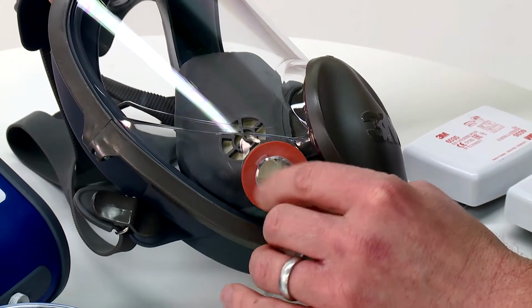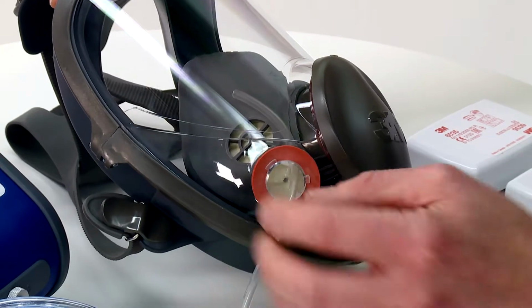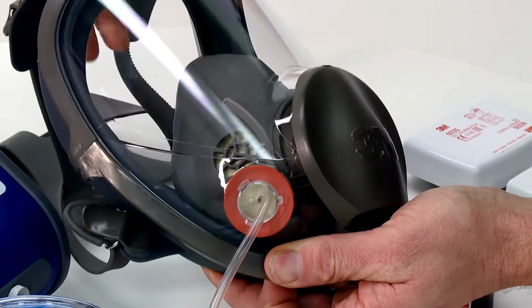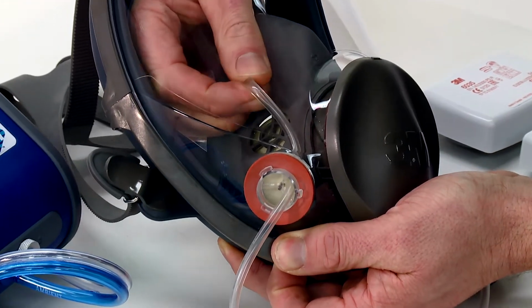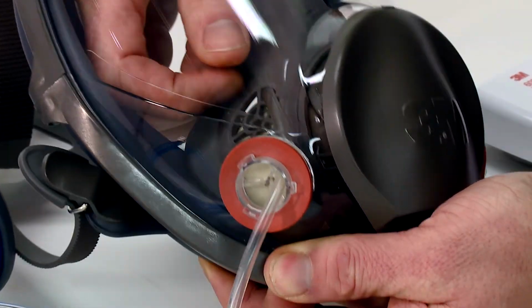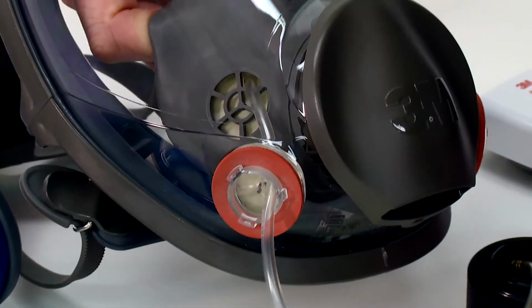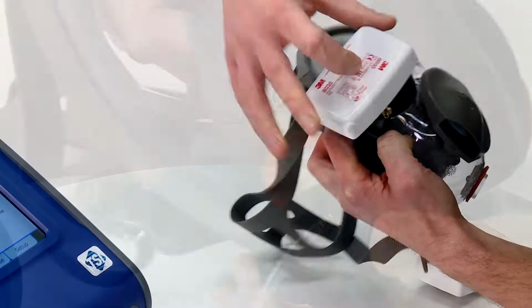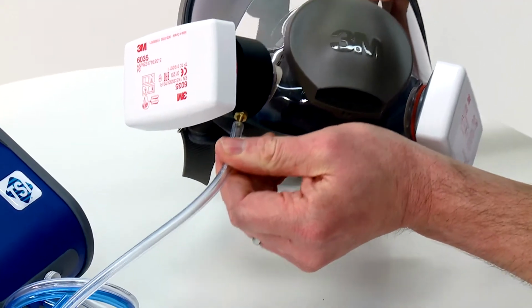For full face masks, the procedure is very similar to that for a half mask. Feed the tubing connected to the 601 fit test adapter through the inhalation valve of the mask and then through the inhalation valve of the nose cup assembly. Cut the tubing to length. Terminate and secure within the mask. Connect P3 particulate filters and the clear tube to the probe.